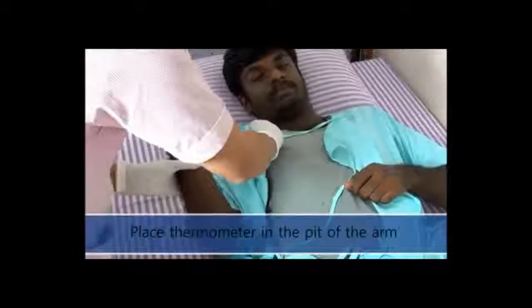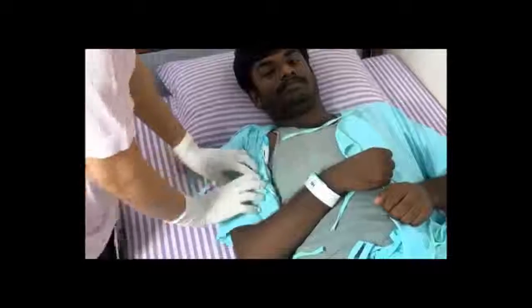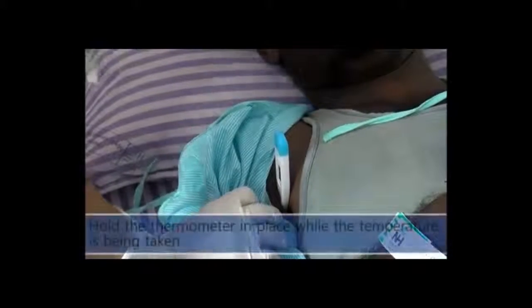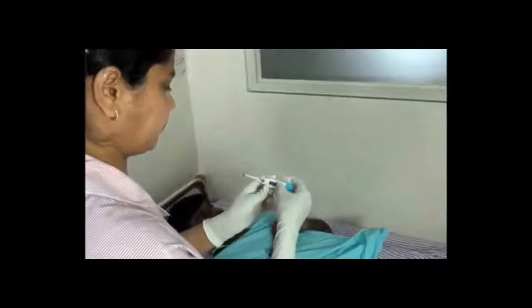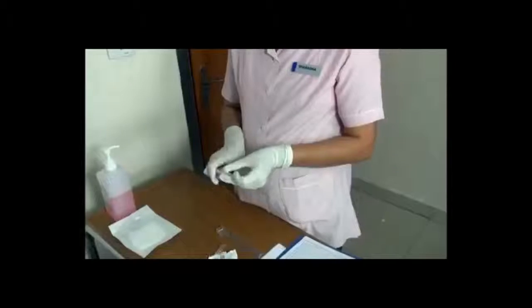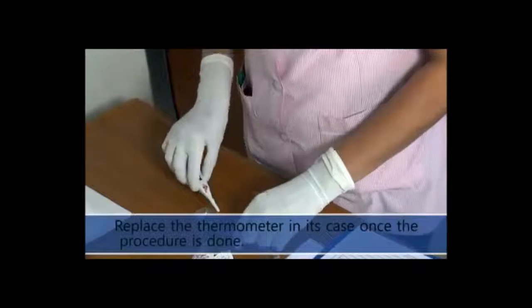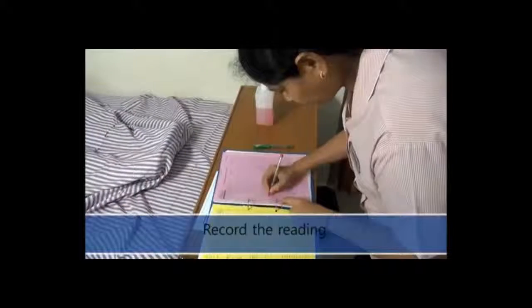Place the thermometer in the pit of the arm. Hold the arm close to the body. Hold the thermometer in place while the temperature is being taken. Replace the thermometer in its case once the procedure is done. Record the reading.